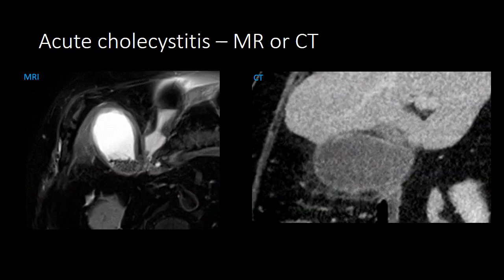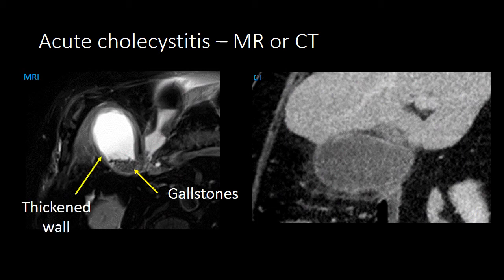Acute cholecystitis can also be diagnosed on CT or MRI. In the first example, we have an MRI image of the gallbladder. We can see small gallstones in the neck of the gallbladder, the gallbladder wall is thickened, and we can also identify inflammatory stranding next to the gallbladder.